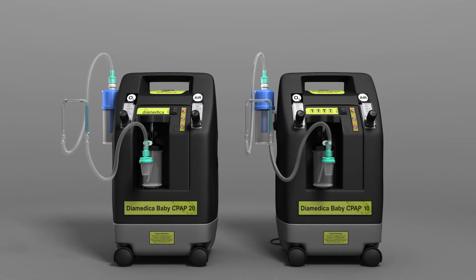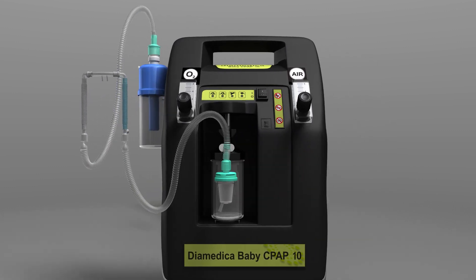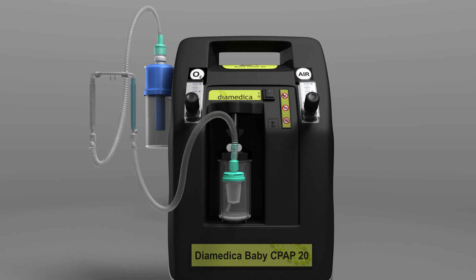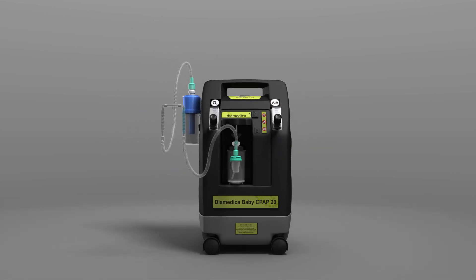Diomedica offers two bubble CPAP options: CPAP 10, designed for neonates up to 5 kilograms, and CPAP 20, designed for neonates and paediatric patients up to 20 kilograms.